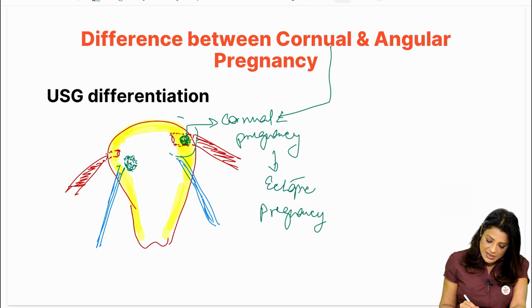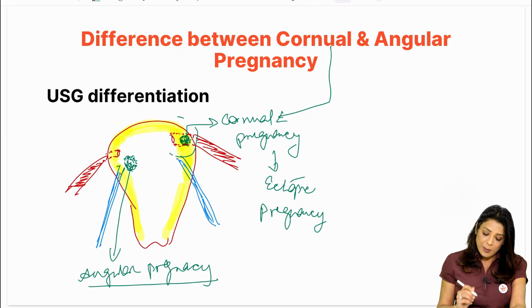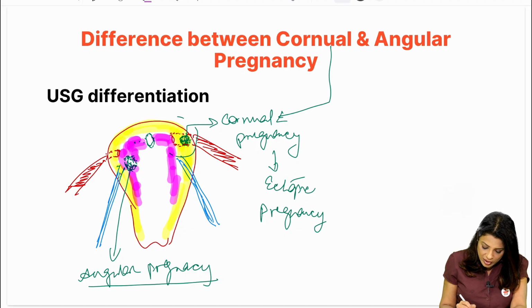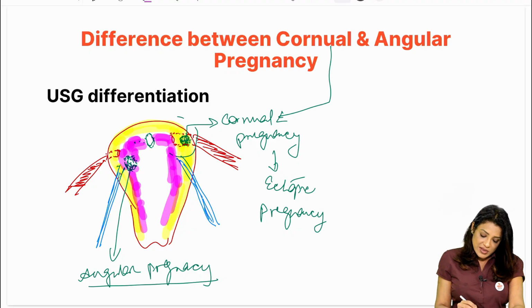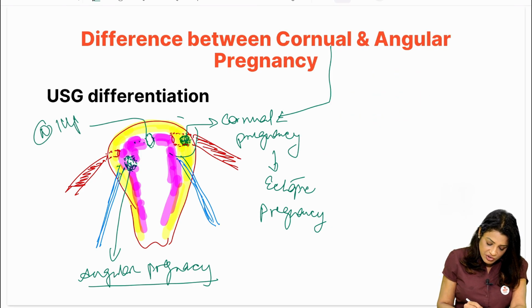Okay. Now this pregnancy, look at here. This pregnancy is an angular pregnancy because although it is intrauterine, it is said to be intrauterine, it is not an ectopic, but it is not a normal gestational sac which should be lying somewhere here. Eccentric location of the gestational sac, we know it embeds inside the, if I draw this endometrium also here, so it will embed inside it, right? So this will be the normal intrauterine way, implantation of pregnancy.